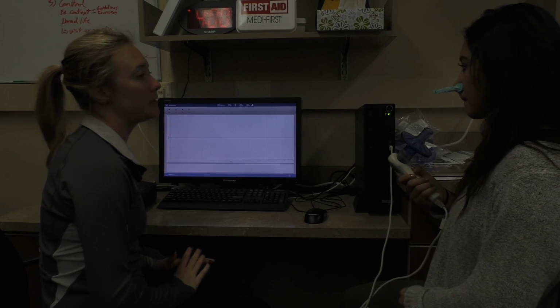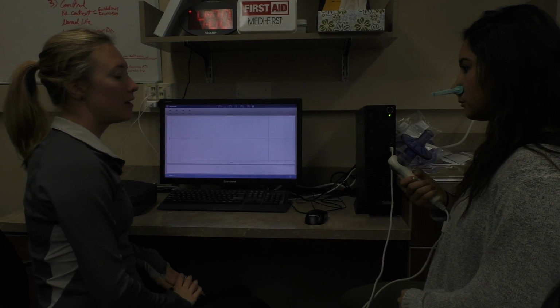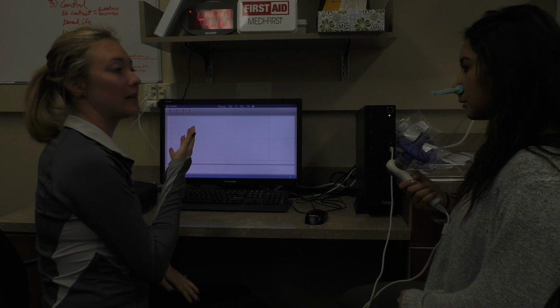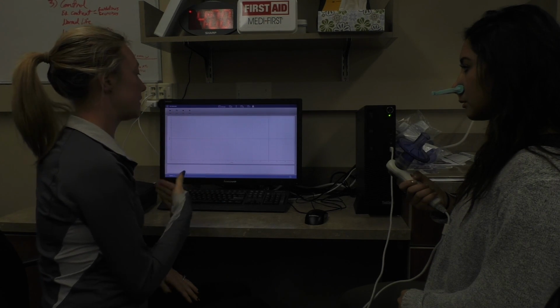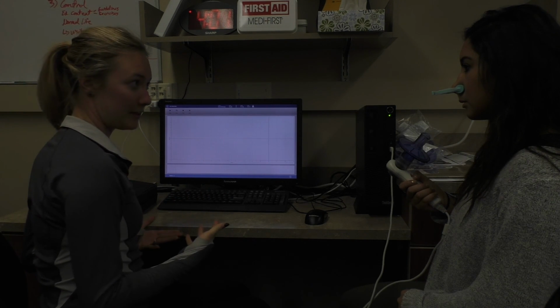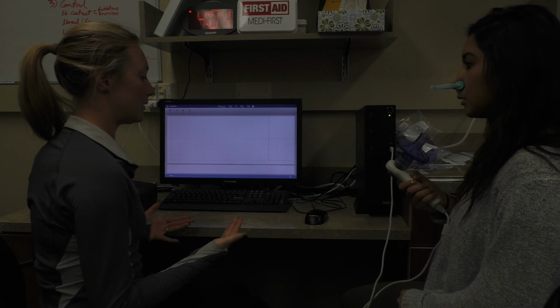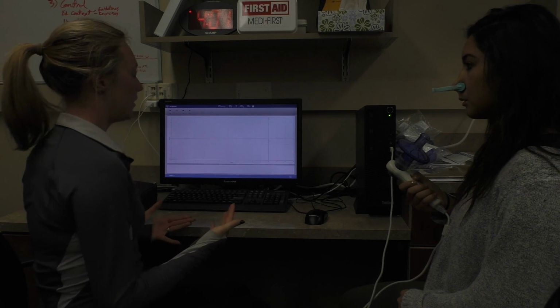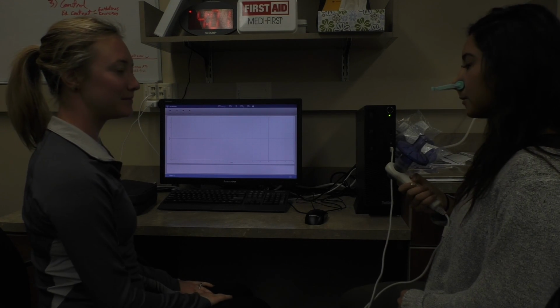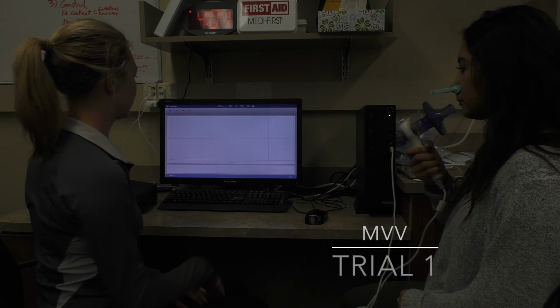All right, so we're going to be doing an MVV measure today. So what I'm going to have you do is you'll be wearing the nose clips. You'll be breathing in the spirometer naturally, but when I tell you to go, you're going to basically be hyperventilating for 12 seconds. So really going in and out. And again, that has to go to 12 seconds. All right? Okay. This will be MVV trial 1.